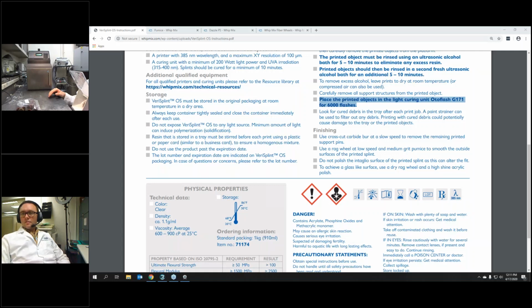All right. We did have another one come in. Let's see, the curing won't change the dimension of the appliance as we have an analog process, and why? The question is why, with an analog process, do you see more dimensional change during curing than when you do it here? The main reason is that the different chemistries don't have the same amount of shrinkage as the other acrylics that we'd use in an analog process. They're down in the half to probably 1.5% range, whereas in some of the analog acrylics, you can have up to 16%.